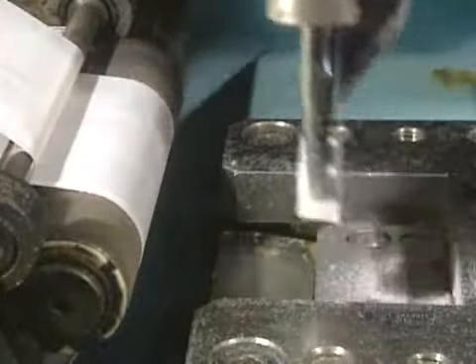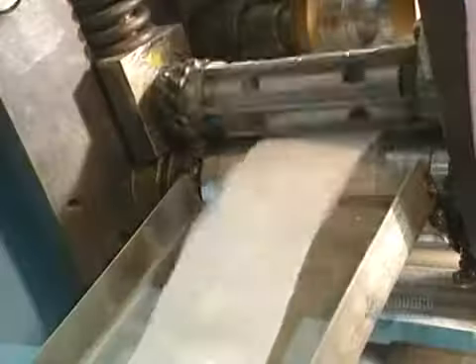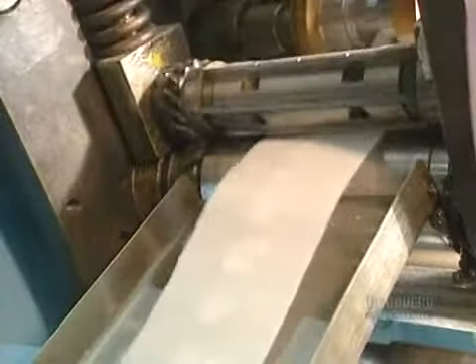Once this is done, the bandage is drawn by suction with a robotic arm and placed between two wrapping papers. In slow motion, we can see the wrapping action better — this machine is much faster than the eye. At full speed, it can wrap 300 bandages a minute.